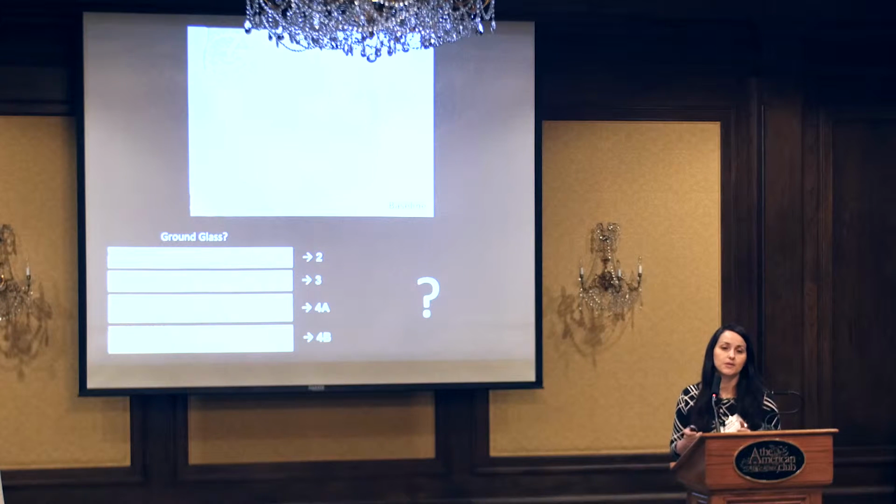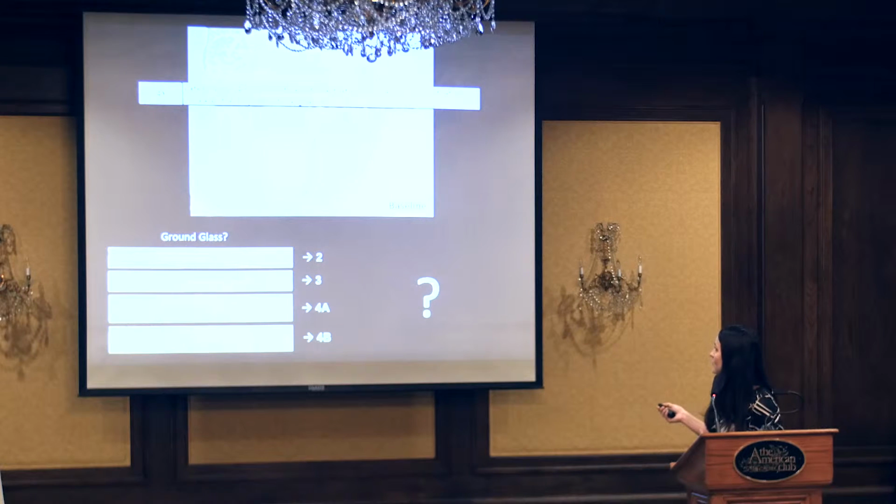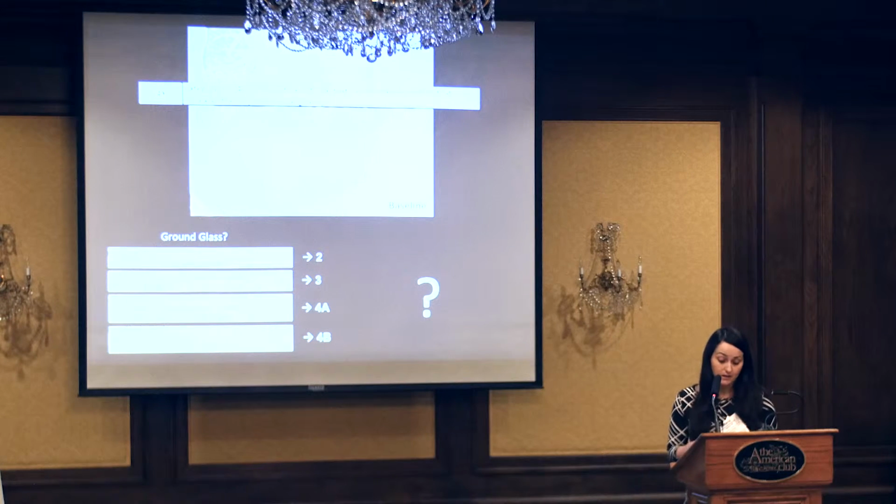We all agree on something, though. It looks like something that needs to be taken out. It looks like a cancer. It was a cancer. And there is one thing that was already mentioned, that you have a good modifier here, the X. At the STR last month when we were there, they said that if something doesn't look right and looks worrisome, just add the X and tell them that it's suspicious. And that's your way also of being a clinician and telling them, I know that we don't have a comparison, but this just looks like cancer.